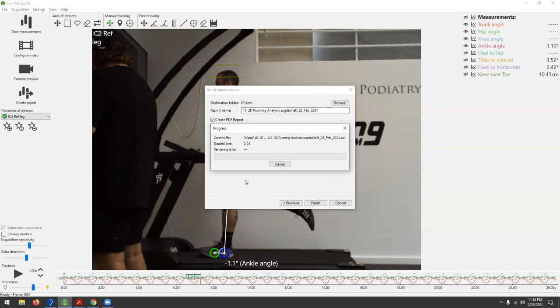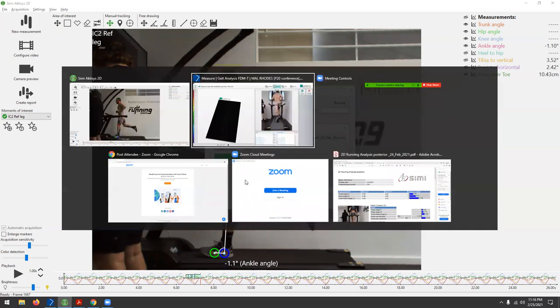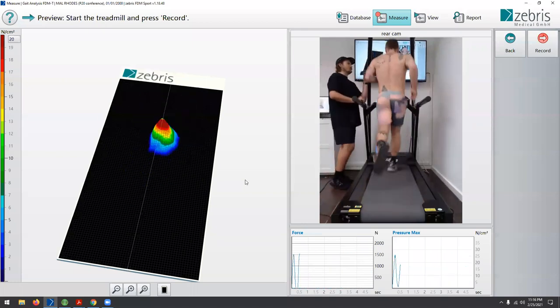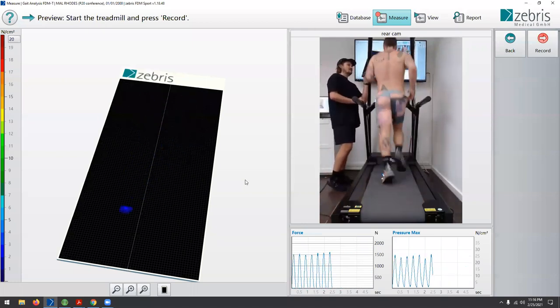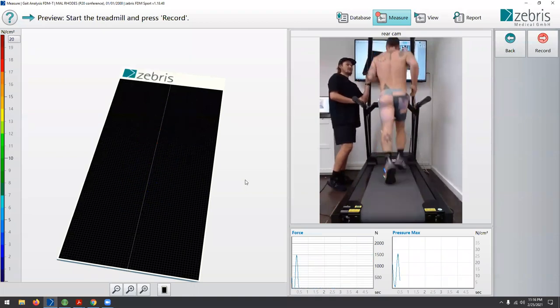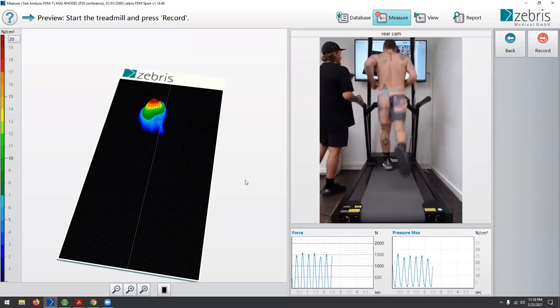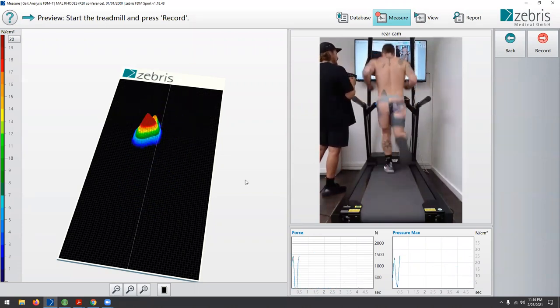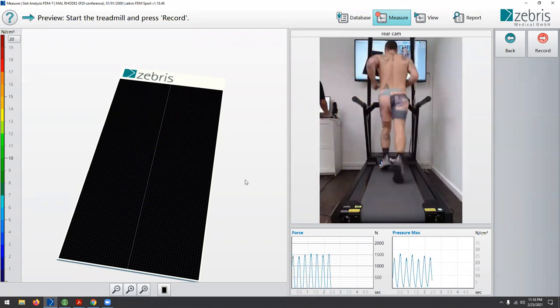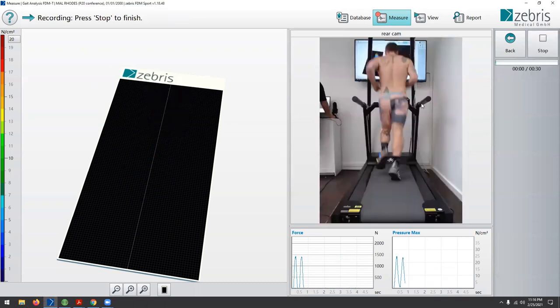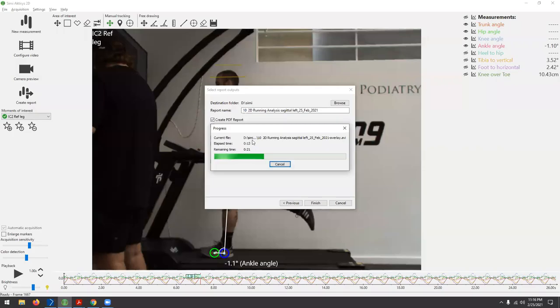I'll take another capture. With the Zebris I'm going to turn off the metronome — I want Mel to keep the beat in his head while I turn it off — and then get him to run again. I'm starting to look at what changes that produces in these gait parameters.